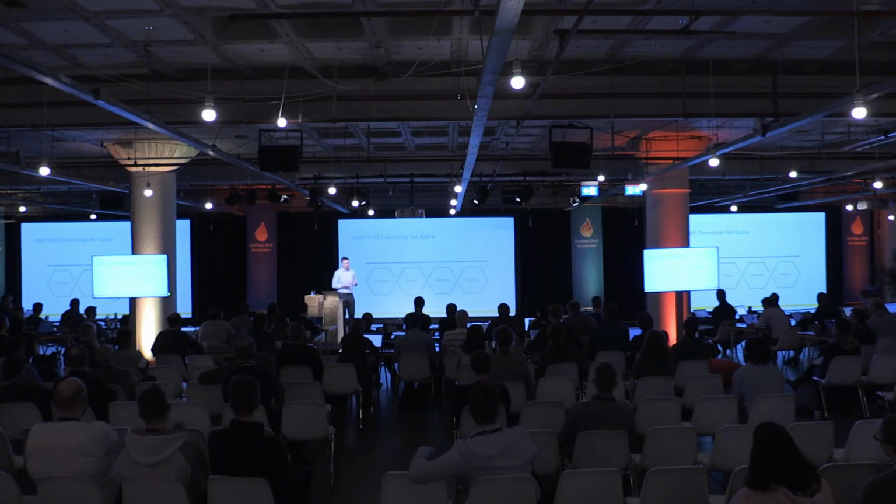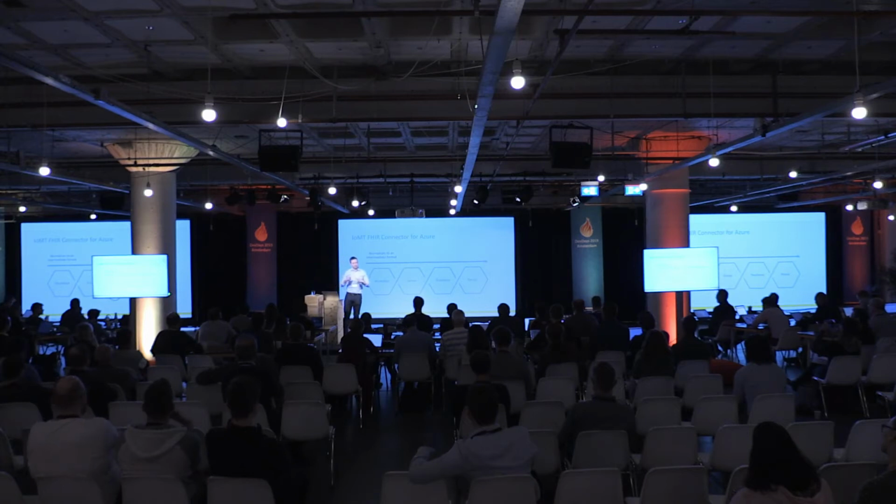So that brings me to the IoMT FHIR connector for Azure. We group things up into 4 distinct steps in how we process the data that's coming in. So first we normalize. On ingest, we interrogate the payloads and we extract values, and we see what do we know, and we put them into an intermediate format. Still not FHIR, but it serves as a pre-step for the next processing, in which we group.